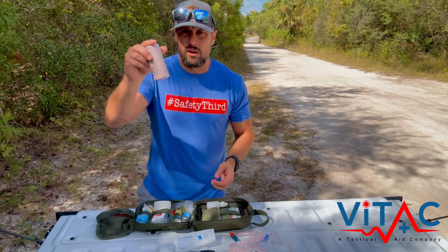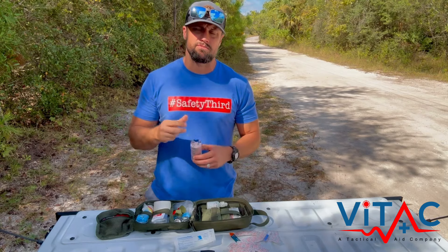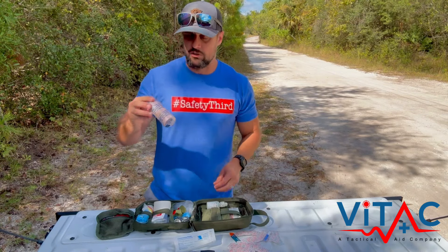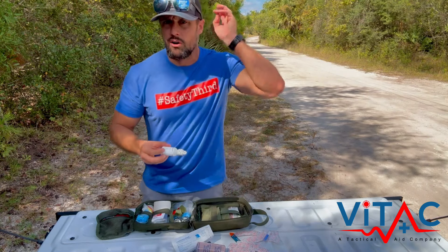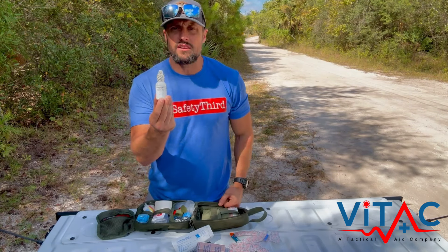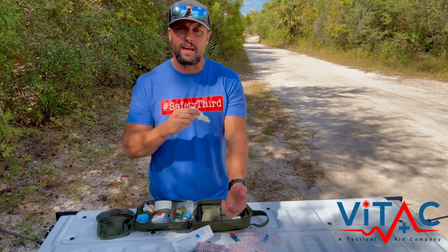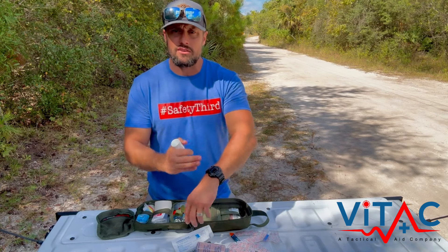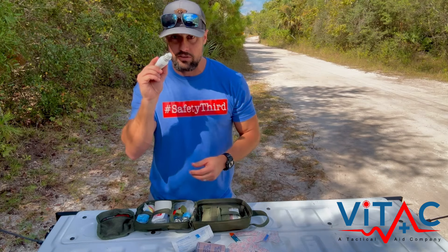You're going to notice a four-inch elastic wrap, ace wrap, whatever you want to call it. This is great for wrapping any kind of ankles or joints that get sprained or twisted, and it's also good to have as a covering over other wounds. The other thing you've got here is some eyewash — perfect if you get something in your eye, but also great if you want to irrigate a wound, like if you got road rash and want to hose off some dirt.